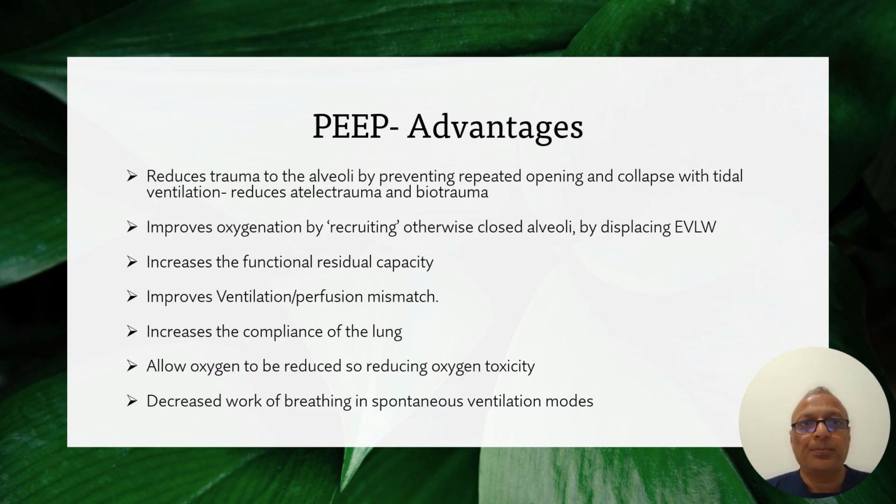The application of external PEEP has several advantages for the patient. It reduces trauma to the alveoli by preventing repeated opening and collapse with tidal ventilation. Hence, it reduces atelectrauma and biotrauma. It improves oxygenation by recruiting otherwise closed alveoli and by displacing extravascular lung water if there is pulmonary venous congestion, as in pulmonary edema. It increases the functional residual capacity and improves ventilation perfusion mismatch.